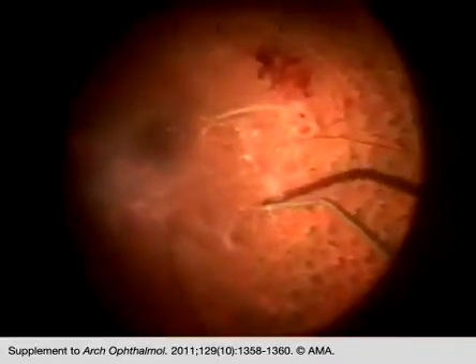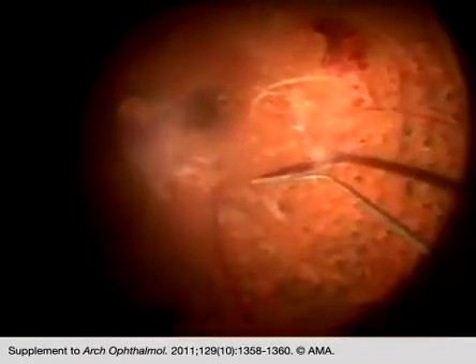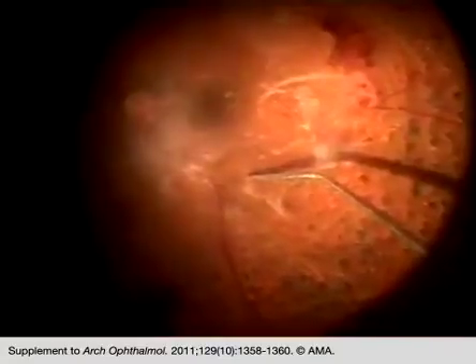Here we see how we can separate the vascularized posterior hyaloid face from the retinal surface, allowing us to perform a safe and careful dissection.